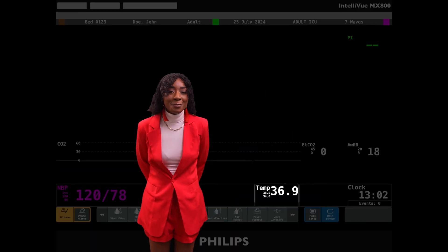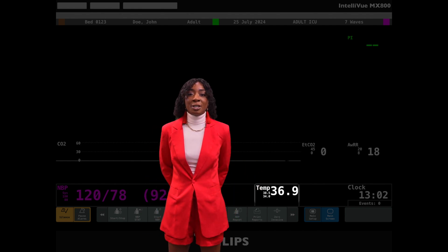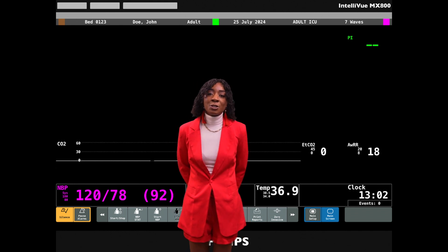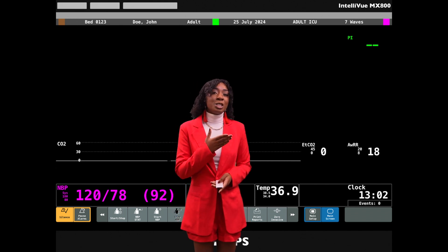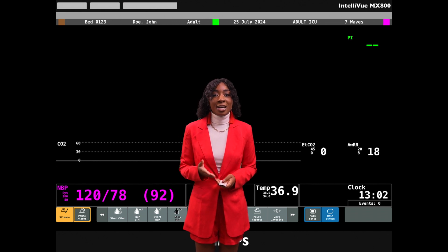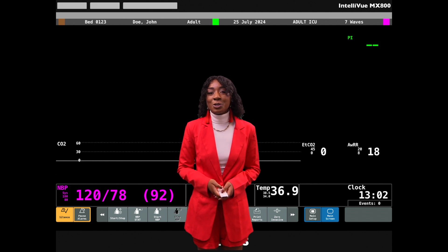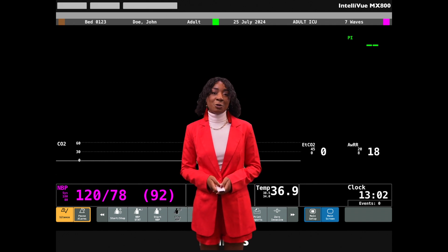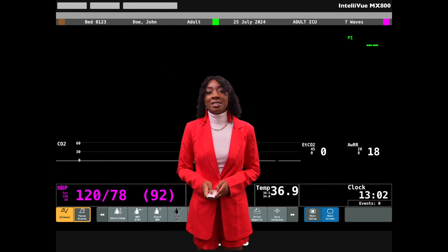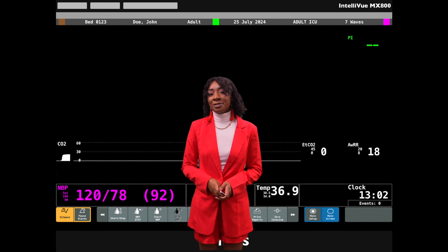Now on to temperature, often listed at the bottom of the monitor. It will be reported in either Celsius or Fahrenheit. The main thing to remember is that temperature is most often a static value — it must be manually updated. On certain occasions, temperature can be measured in real time using a continuous probe, which can be inserted rectally or esophageally. In this case, you can more reasonably assume that the information presented is current.